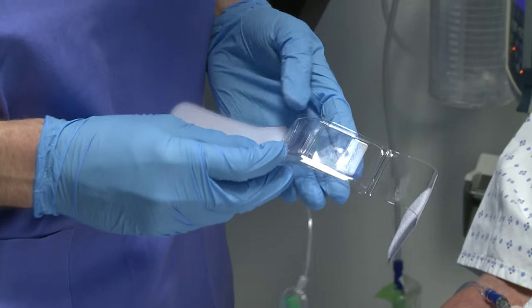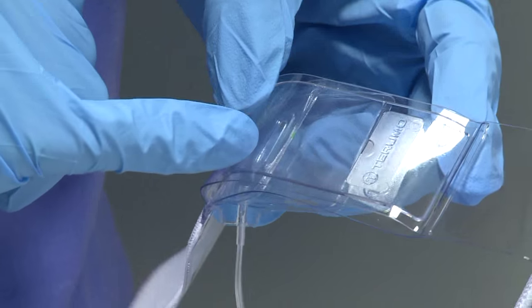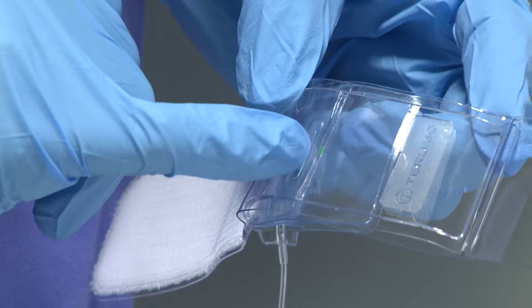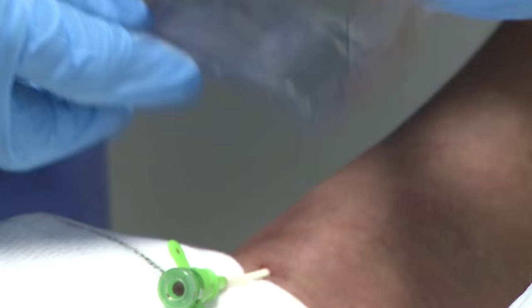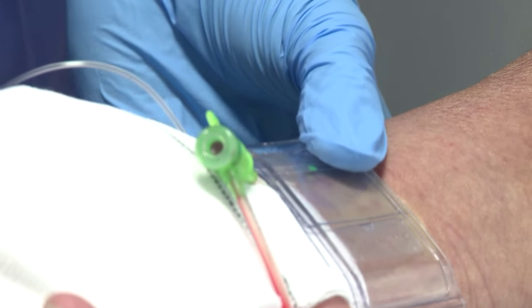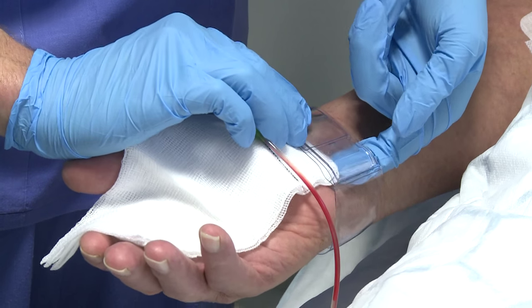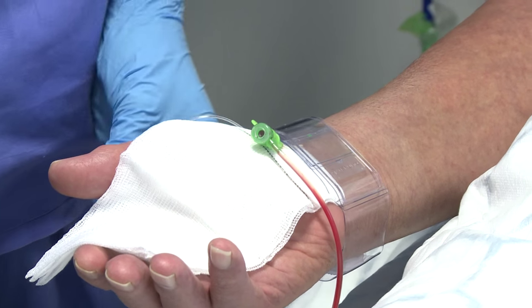As you may already be familiar, the TR band has two balloons which will inflate and place pressure over the radial artery. Very usefully there is a green marker that we use to sight it on the surface of the wrist, with a plan to place that just a millimetre or two above the skin puncture site. Here we place the band — this is a large band in this instance due to the gentleman's wrist size — placing the Velcro strap posteriorly, then checking we have adequate space within the ulnar area to ensure continued circulation via the ulnar artery.